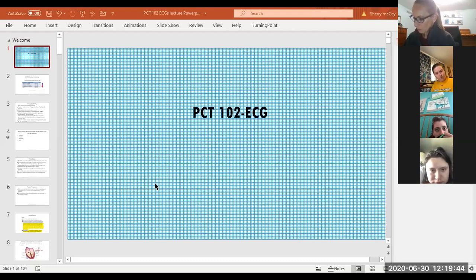Where do you guys think that it should be? Let's go through that question, okay? Just so we know it. White on right should be where? Right shoulder. Black and white should be? Left side. Right shoulder. Left shoulder. Yep. Smoke over fire is? Left side. Snow over grass. Right side. Okay, and then the brown? Fourth and fifth intercostal space. Right. Okay, so I'm going to give credit for that one, okay?